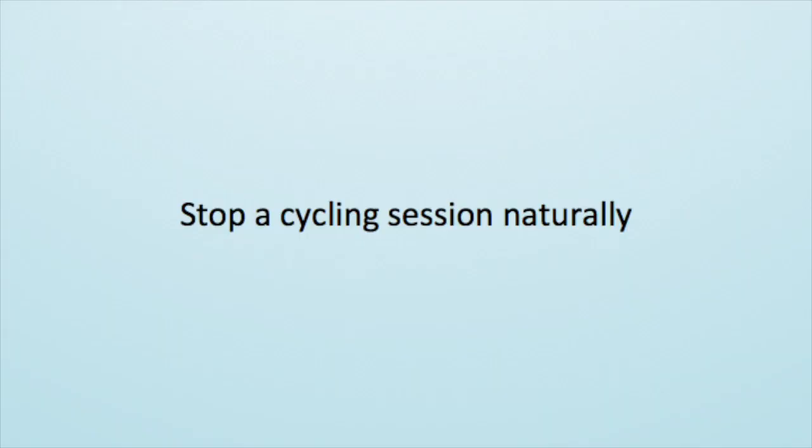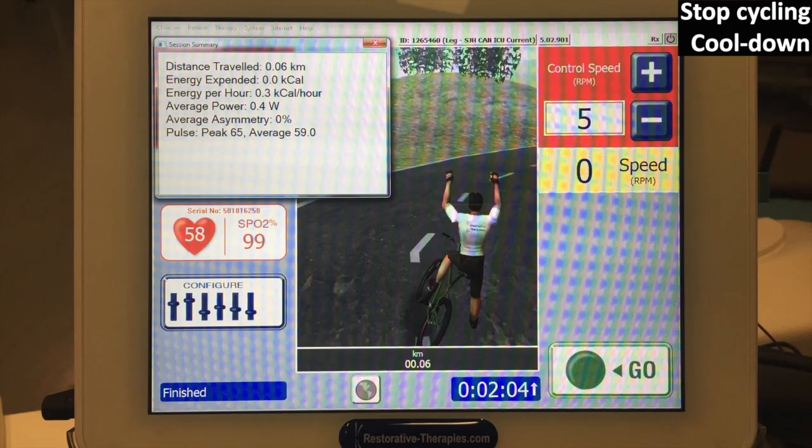If you don't interfere and let the cycling session run naturally, the therapy session will automatically conclude at 30 minutes with a 30-second cooldown. Once the session concludes, the data will automatically be stored to the tablet, so there is no need to close the patient. Please note the distance of the cycling session.